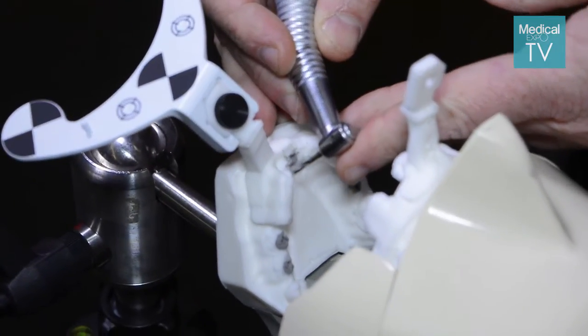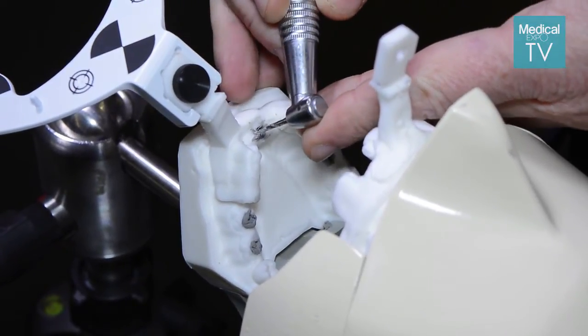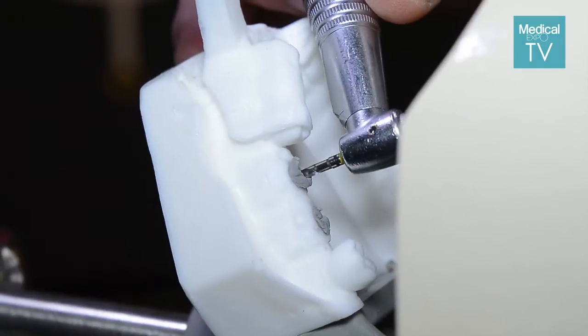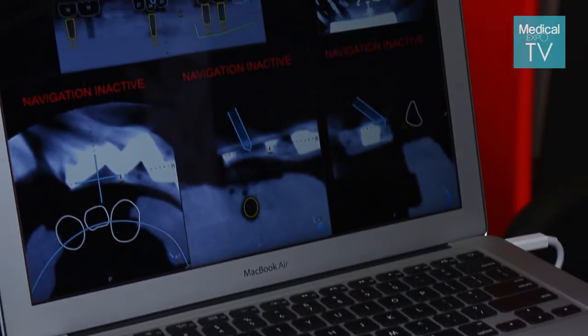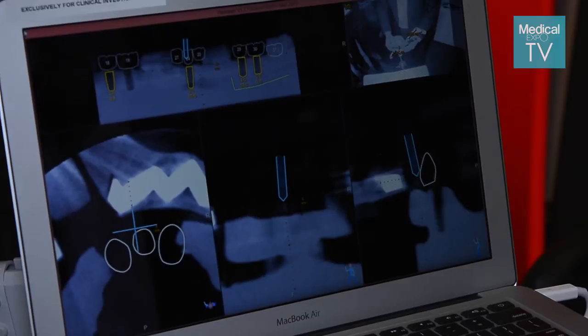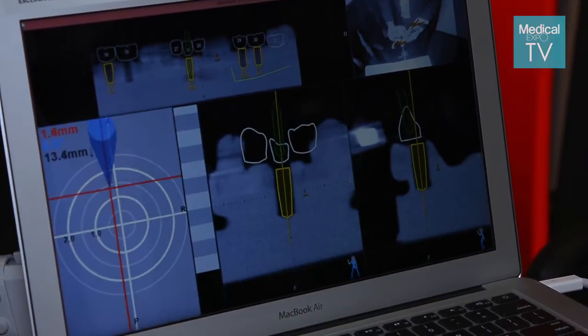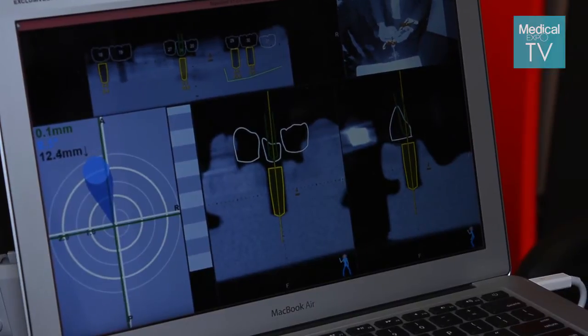The final stage is actually placing the implants where you planned. Our tracking camera tracks the position of the handpiece and the position of the jaw during surgery, to map the tip of the drill to the CT scan, so that wherever you placed the virtual implants will guide you where you're actually going to drill to place the actual implants.